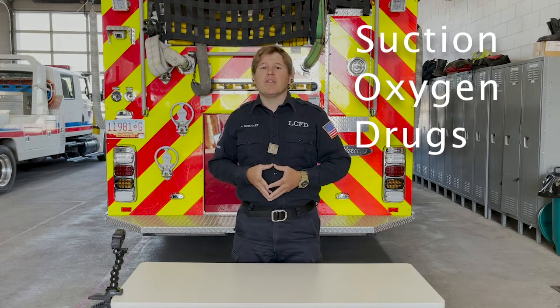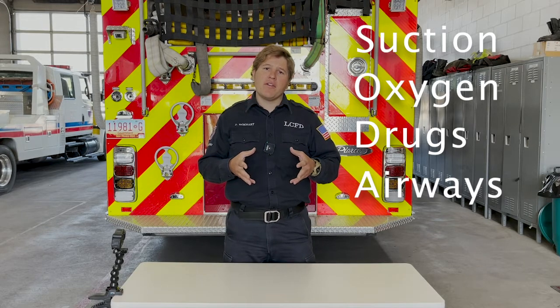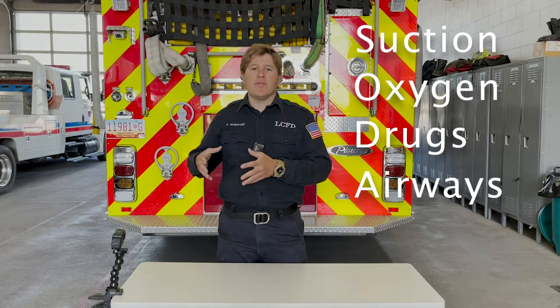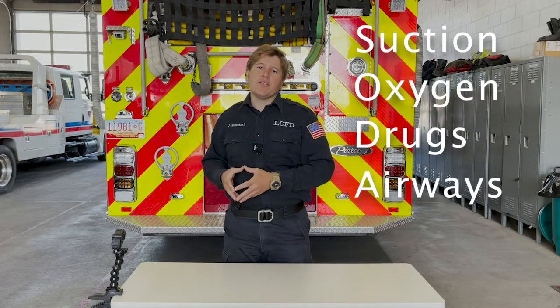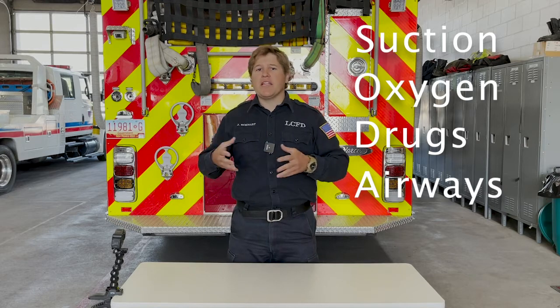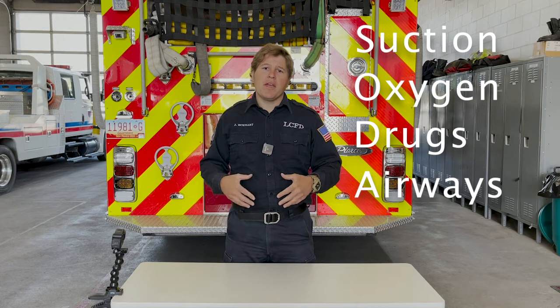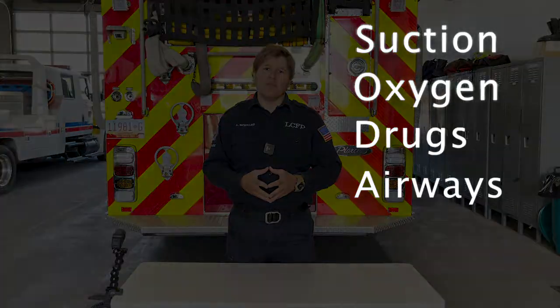The last one is A, and that's airways. That is not only your basic airway adjuncts, but all the way up to your intubation, and also your secondary in case you have a failed intubation. In our case, it would be an LMA. So we'll go through all of the setup and how we can do that in a systematic way to try to help our success in the field.